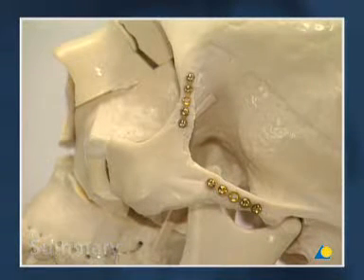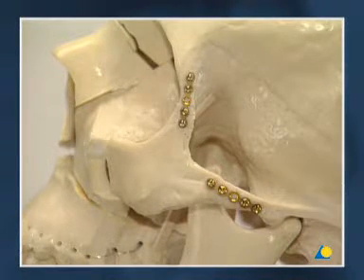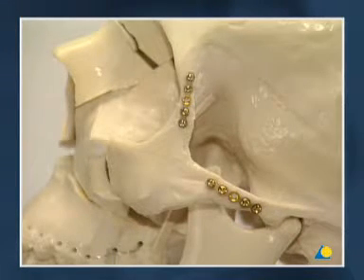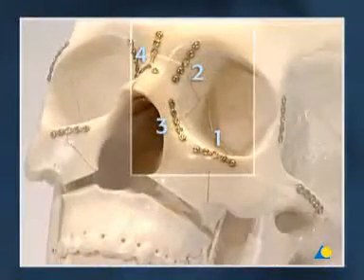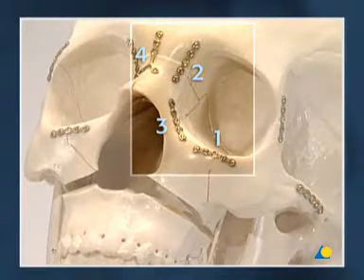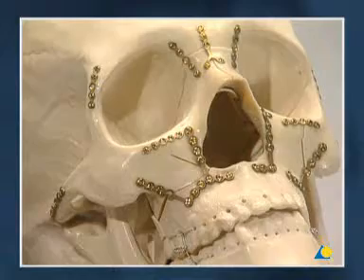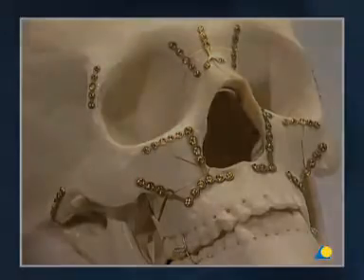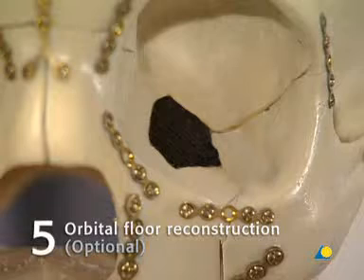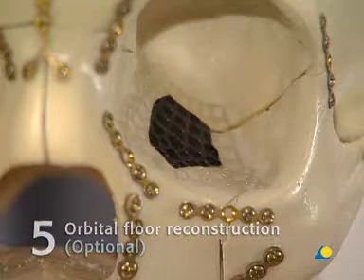Here are the main steps again: fixation of the zygomatico-frontal suture and fixation of the zygomatic arch; plating of the inferior orbital aperture and nasal frontal fracture and fixation of the maxillary buttresses. In case of an orbital wall defect, reconstruction could be necessary.